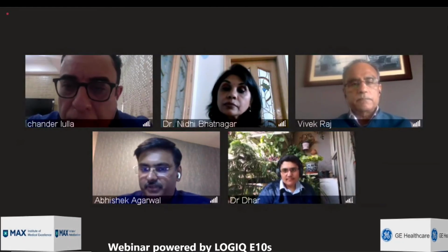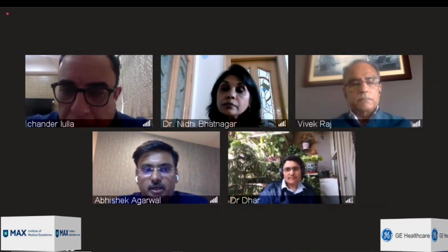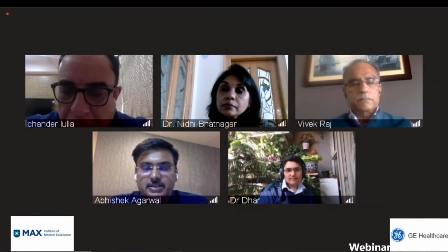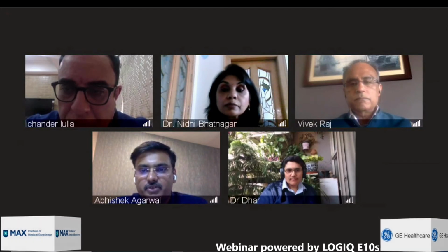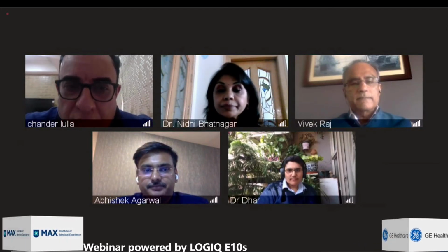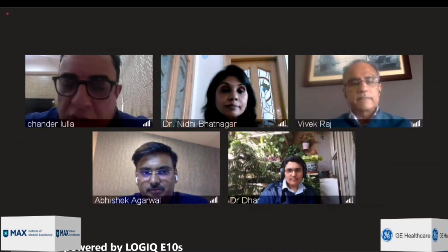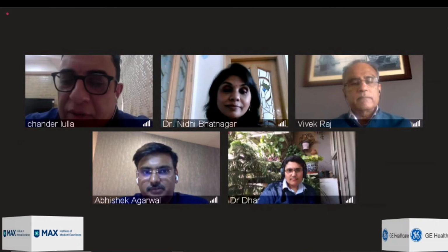So there was a discussion about fasting before elastography and how many hours of fasting is required. What happens if the patient lands up just after a meal? Would you send the patient back or would you still do an elastogram? Dr. Lulla? Yeah, no, we don't send the patient back. If the values are normal, that's fine. If the values are high, we would repeat.